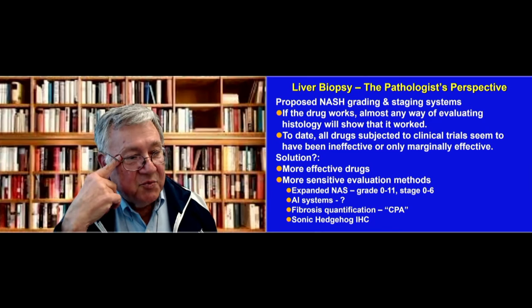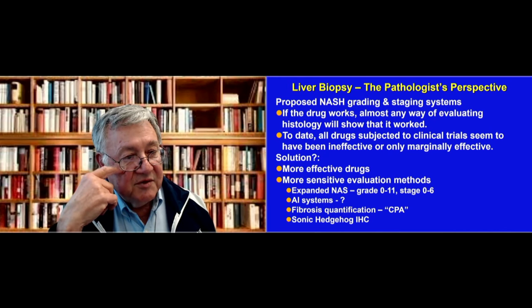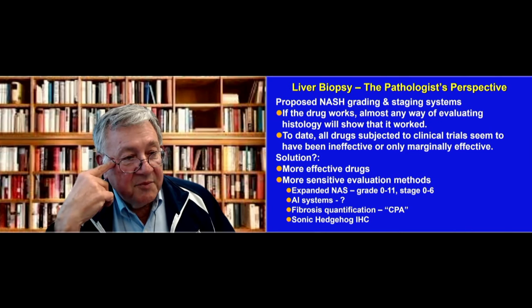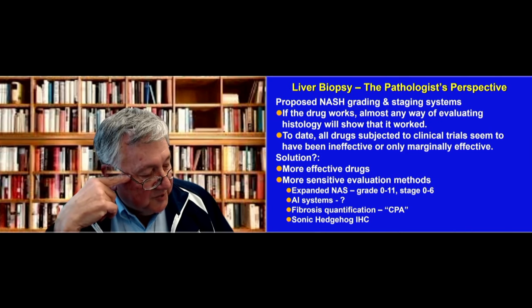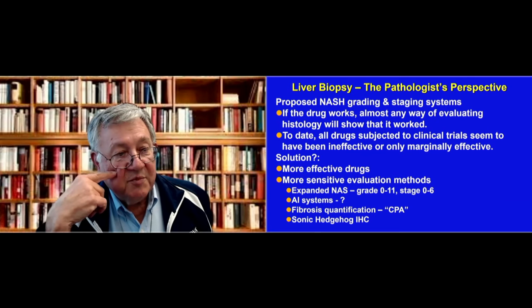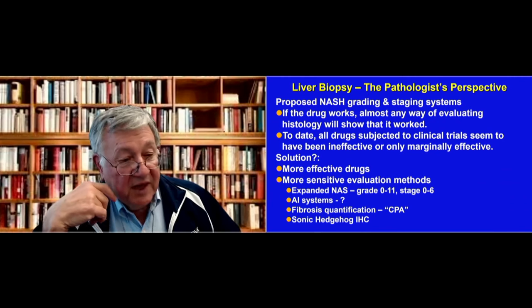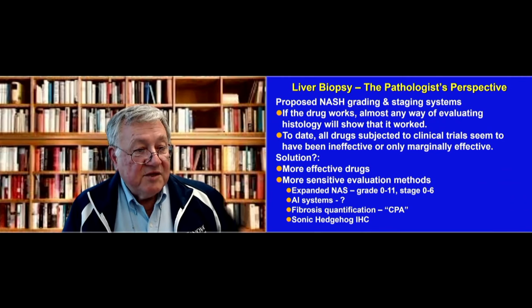I was kind of disappointed in our results because there you could see some cells that were clearly ballooned, but that were negative for the hedgehog ligand. We're hopeful that we'll still come up with something that can be helpful, that can be good at quantifying it. So I think that's my last slide.